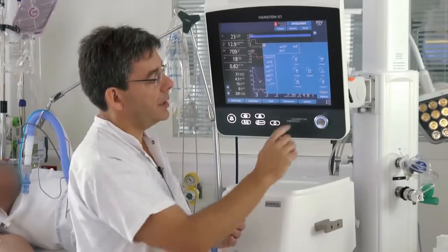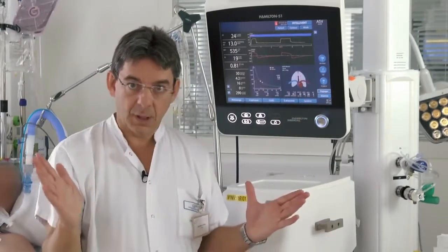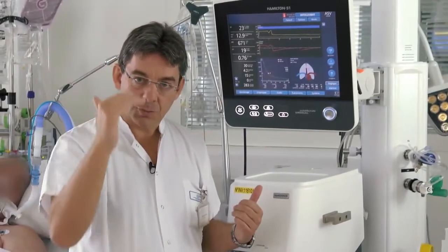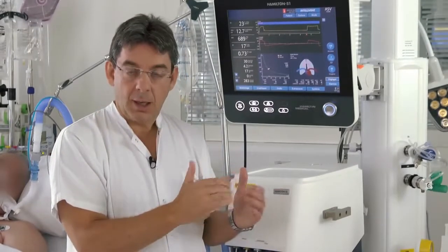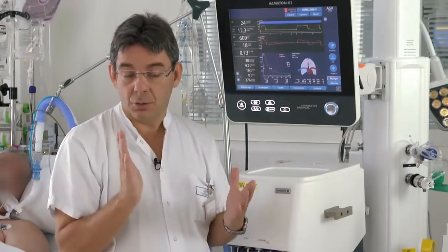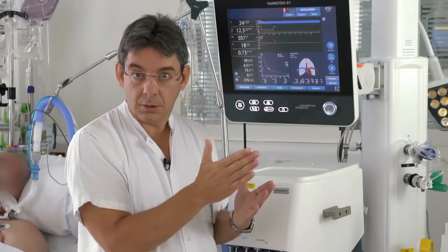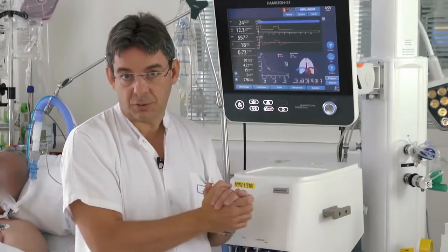If the patient is passive, ASV is a pressure control mode with an automatic adjustment of the pressure control to reach the target tidal volume. The ventilator delivers a mandatory respiratory rate to target the calculated optimal respiratory rate.